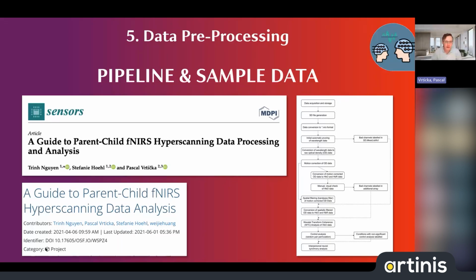And in that guide, we present a flowchart of all the different steps that we think should be done in order to have the best possible data quality for your interpersonal neural synchrony analysis, which is at the very bottom of the flowchart. And as you can see, this involves quite a few steps. And I won't be able to mention all of these steps today, but I will go through some of them and give you some recommendations.